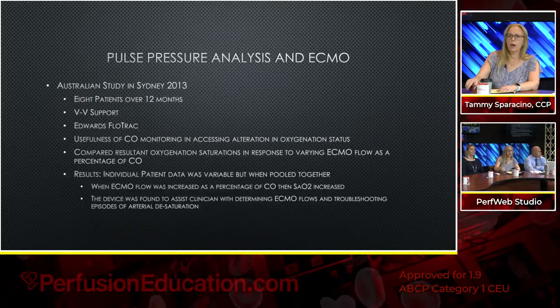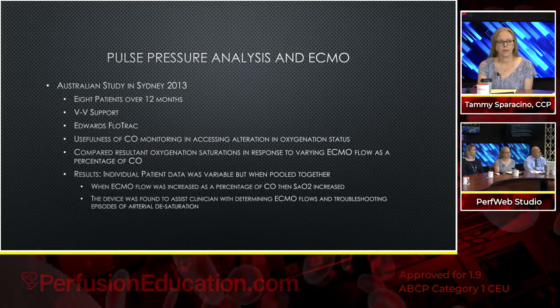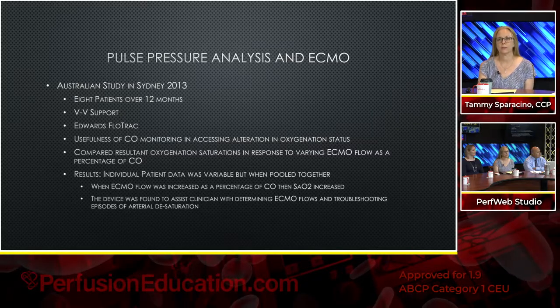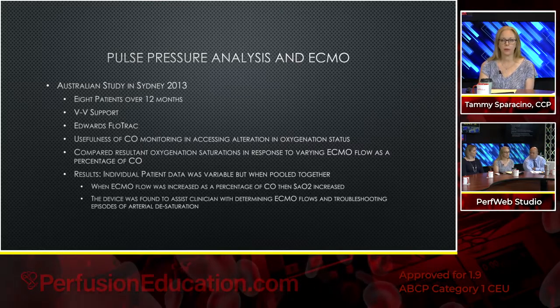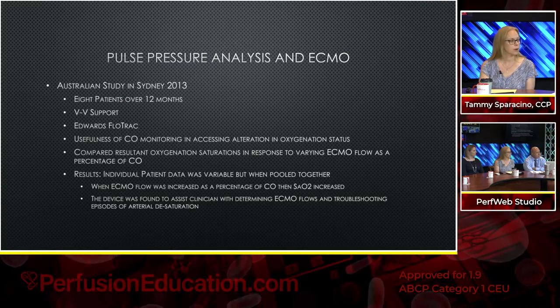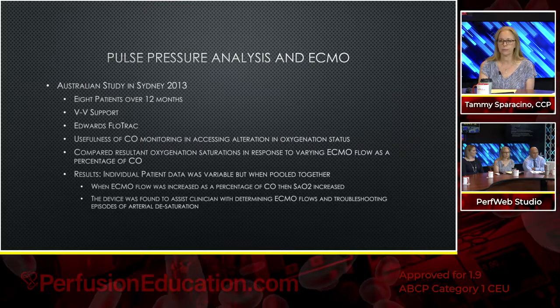Yeah. Okay, so here's what I think after we've talked all about this, kind of thought about these devices and why we have them. What's interesting to us, especially as ICU nurses and perfusionists, is can we rely on these when we have in-line other devices that are doing part of the circulation?